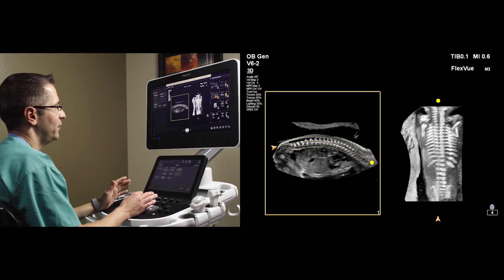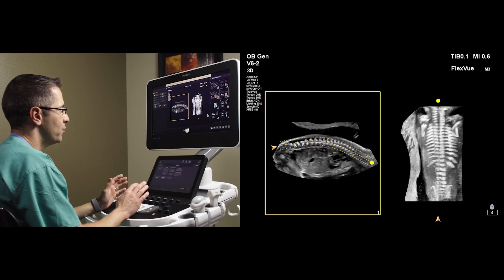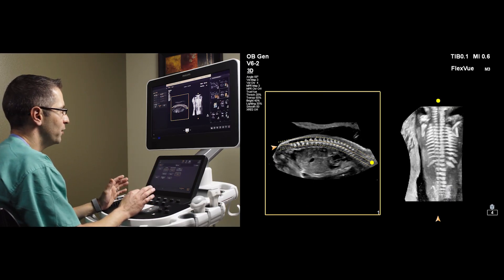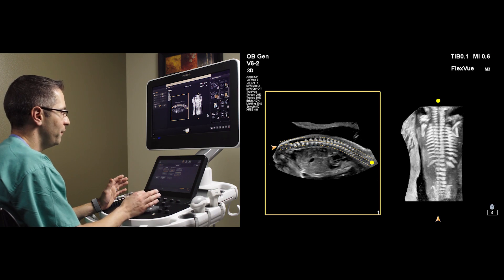Very easily achieved using a new tool, FlexView, available on the Philips EPIC and Affinity systems.